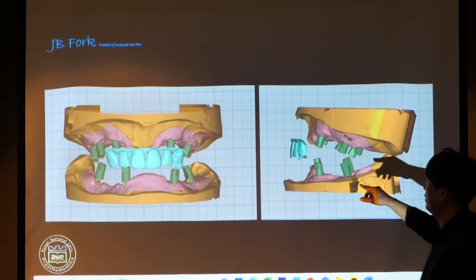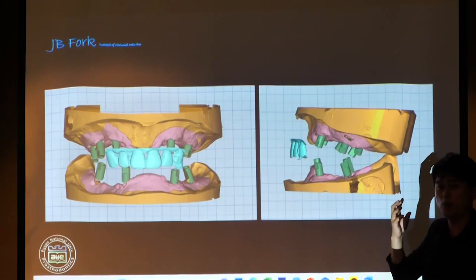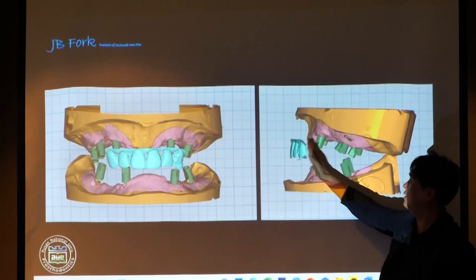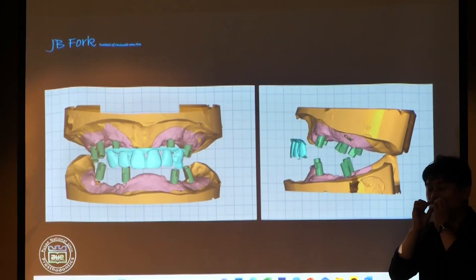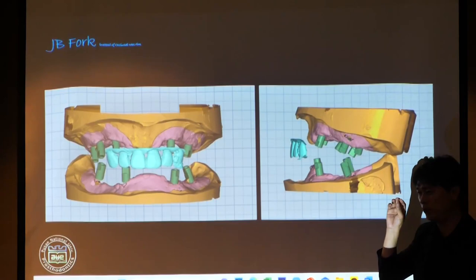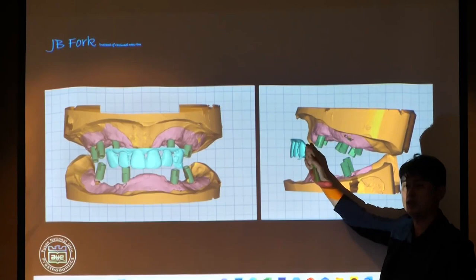So look at this. This patient lost his teeth a very long time ago. Because of that, he had severe bone loss. If I didn't use the JB fork, definitely the dental technician would make the occlusal rim inside compared with the natural teeth. You know, so definitely I would add many waxes to make the lip support when I adjusted the occlusal rim, right? But the JB fork can give me the sight direction, the viewing direction. So we can adjust this anterior teeth position with the patient very easily.